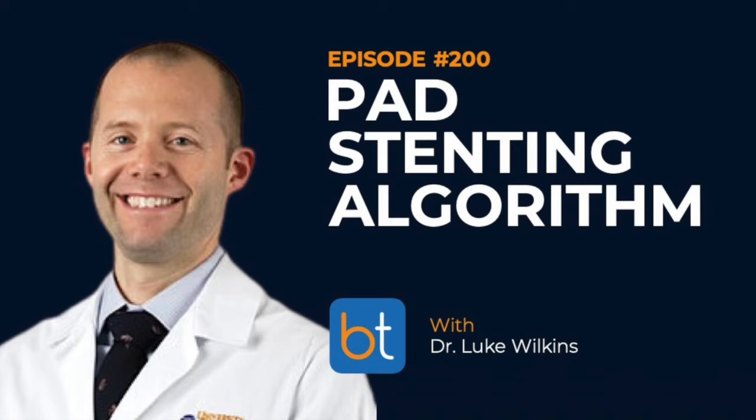So after you've done your treatment, atherectomy plus PTA, then you will do a follow-up angiogram and look for residual narrowing of greater than 30% or a flow-limiting dissection. That sounds pretty self-explanatory. Do you use IVUS in any of these straightforward cases?